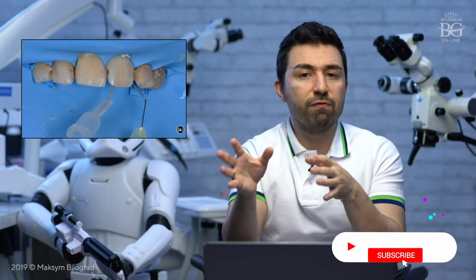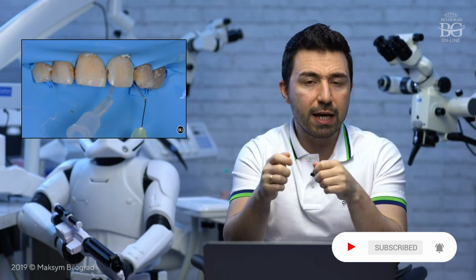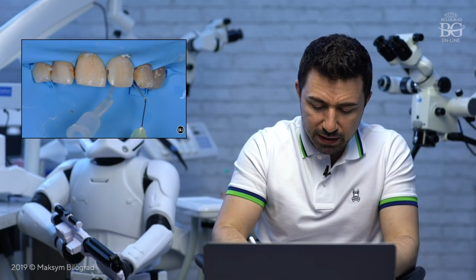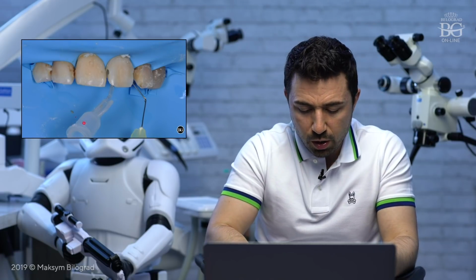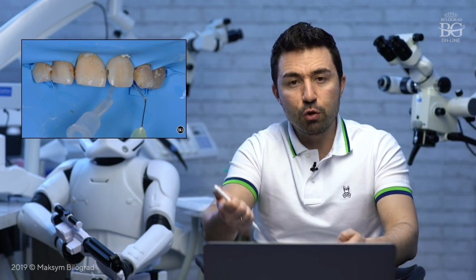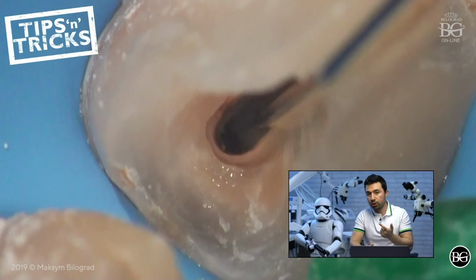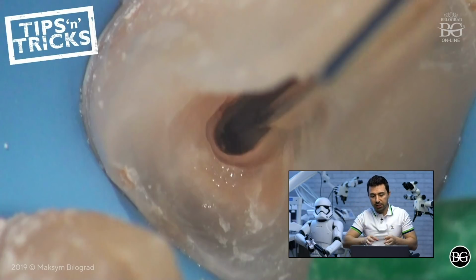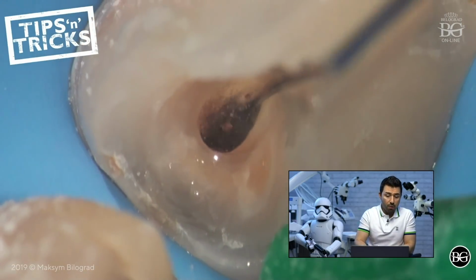If you have the money to invest in that device, it's amazing. But if you would like to save something, you just take a really thin surgical suction tip. Then you can take the tip for calcium hydroxide dressing. This is the one for calcium hydroxide. So you connect this tube to your suction system, and then you put it into the root canal, so this tube will be in the apical part. In this case, when the root canal is pretty wide and straight, it's easy. And here you can see that we can irrigate starting from the orifice, which is simple.